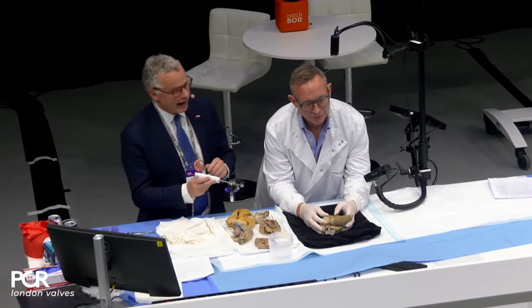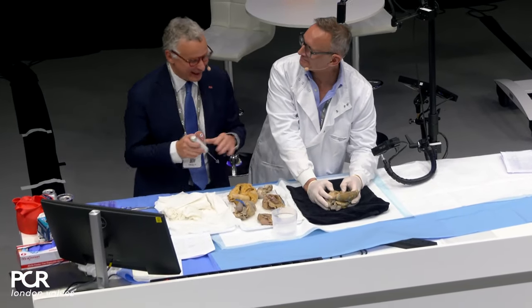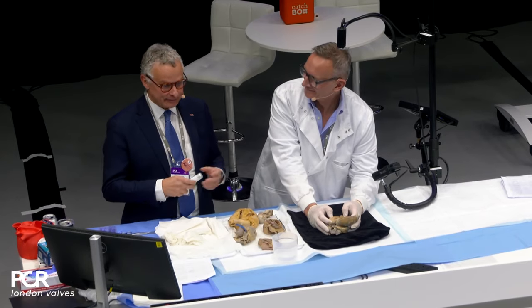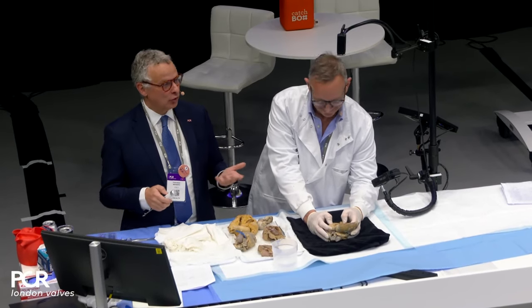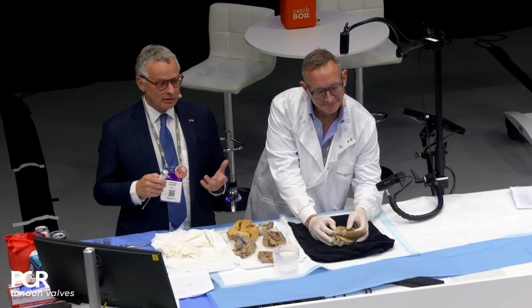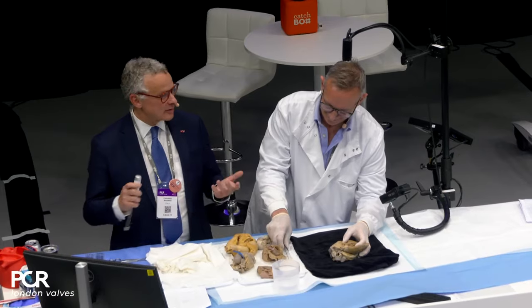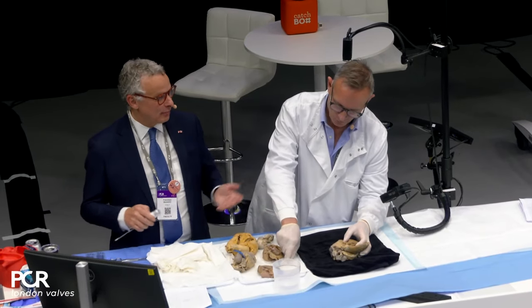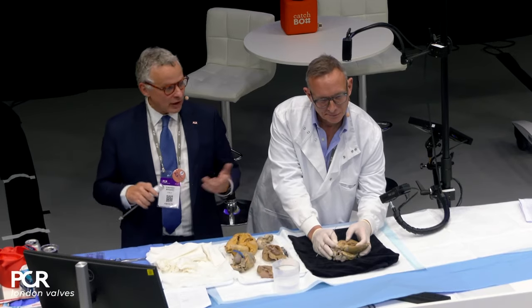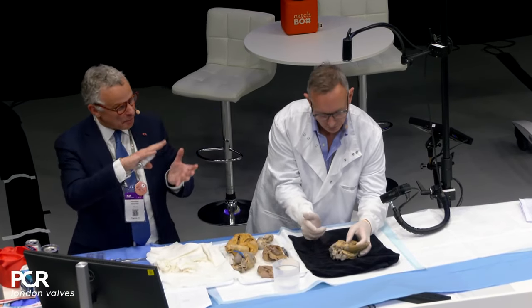When I started clipping in my career, I was together with Antonio Colombo. I don't know if Antonio is here. I hope he's here. But anyhow, I remember at the beginning, clipping was like 2-3 hours. And it was, you know, in the cath lab, Antonio was getting nervous. He was behind my neck and said, "What are you doing?" "Yeah, we're trying to align to the MR jet. You see, this is a posteromedial."